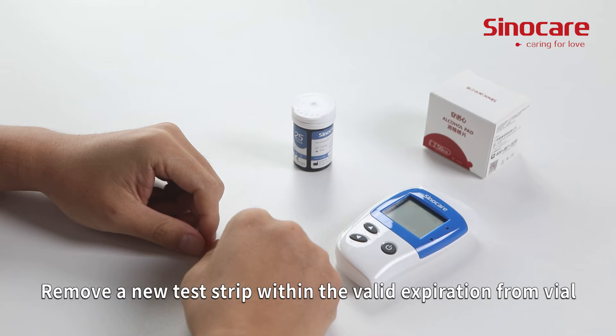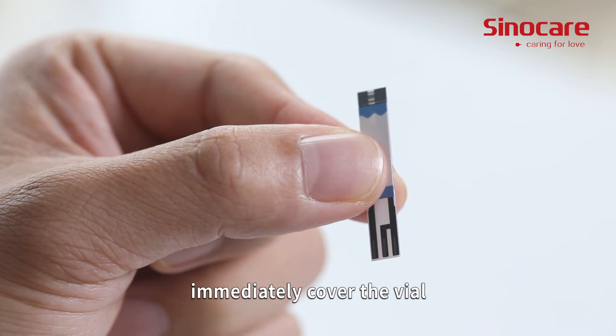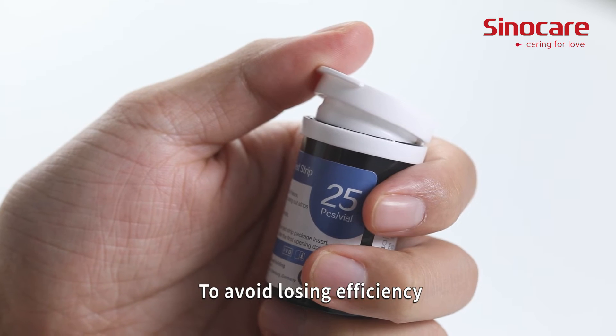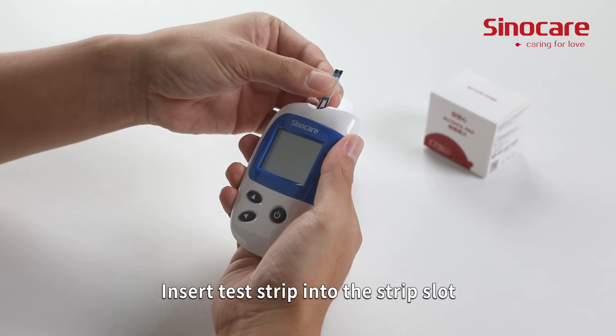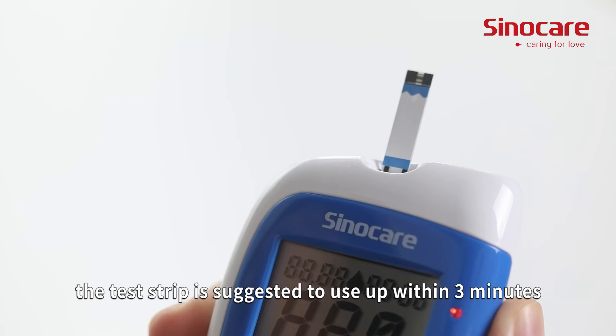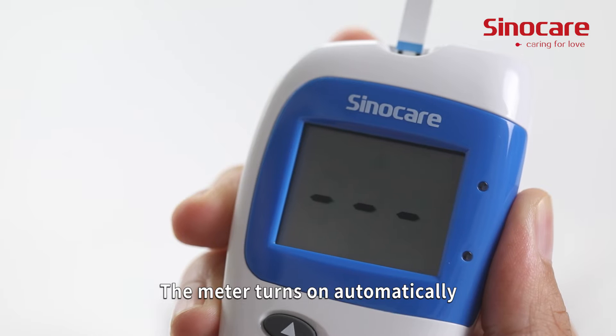Remove a new test strip with a valid expiration date from the vial. After taking the strip, immediately cover the vial to avoid losing efficiency. Insert the test strip into the strip slot. The test strip should be used within three minutes. The meter turns on automatically.